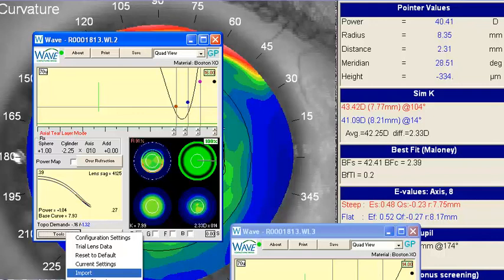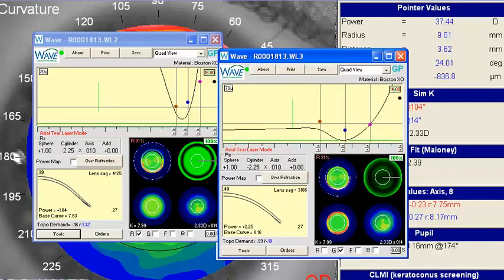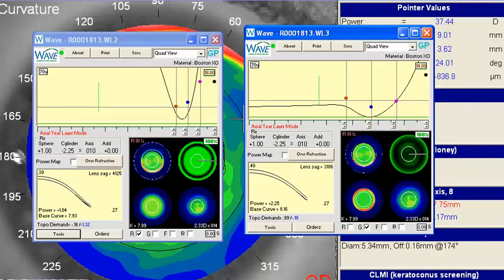If we look at the other design, the smaller lens design, this actually looks like a nice design. The dirty feeling that the patient has with these lenses is probably due to a little bit more movement on this lens than the other one, so she's probably feeling that little lens awareness. If this lens is fitting pretty nicely, don't be afraid to maybe adjust this edge angle a little bit to see if you can reduce some of that dirty lens sensation. Once again, if this was designed with corneal averaging, you're going to run into those weird overrefractions.